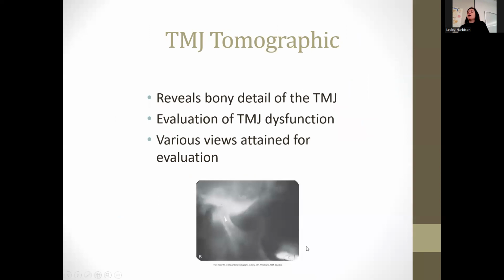Here's a very up close image of the TMJ. This is a TMJ tomographic image. And so this reveals bony details of the TMJ, the temporomandibular joint, and evaluation of any dysfunction in the joint. And then various views can be attained for evaluation.